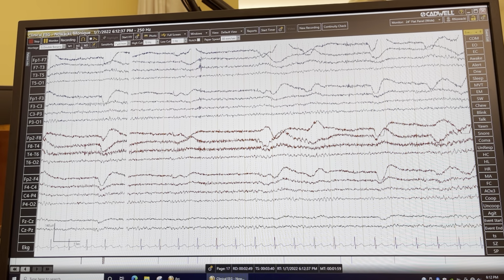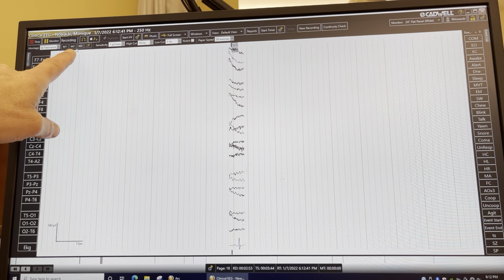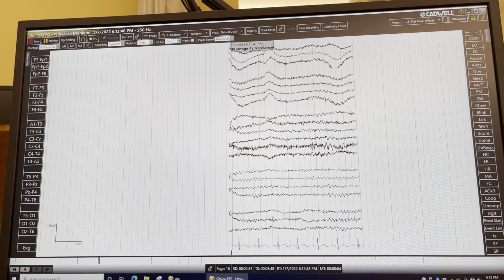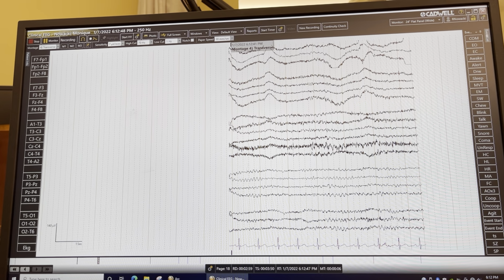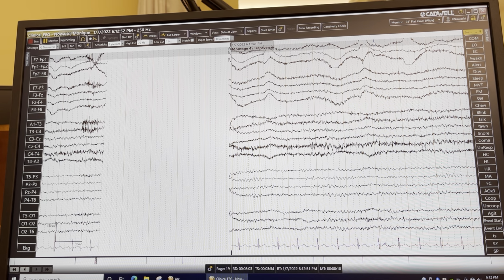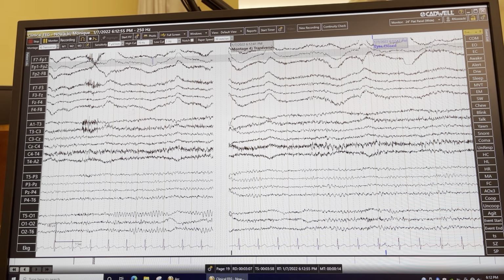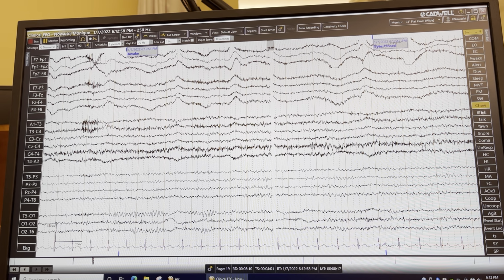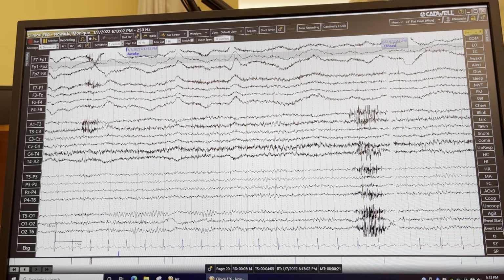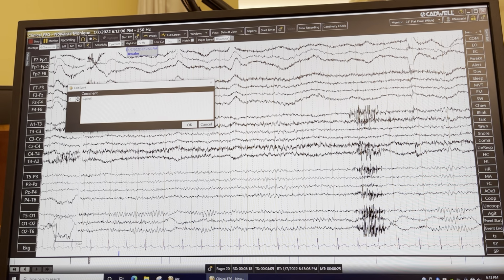So these are the pre-programmed montages. So if you want to go to the transverse, I have programmed as number 2. So now it just changes to number 2. So I'm going to put eyes closed, awake, and then where's my supine one? I had a supine. Anyway, supine, head straight.